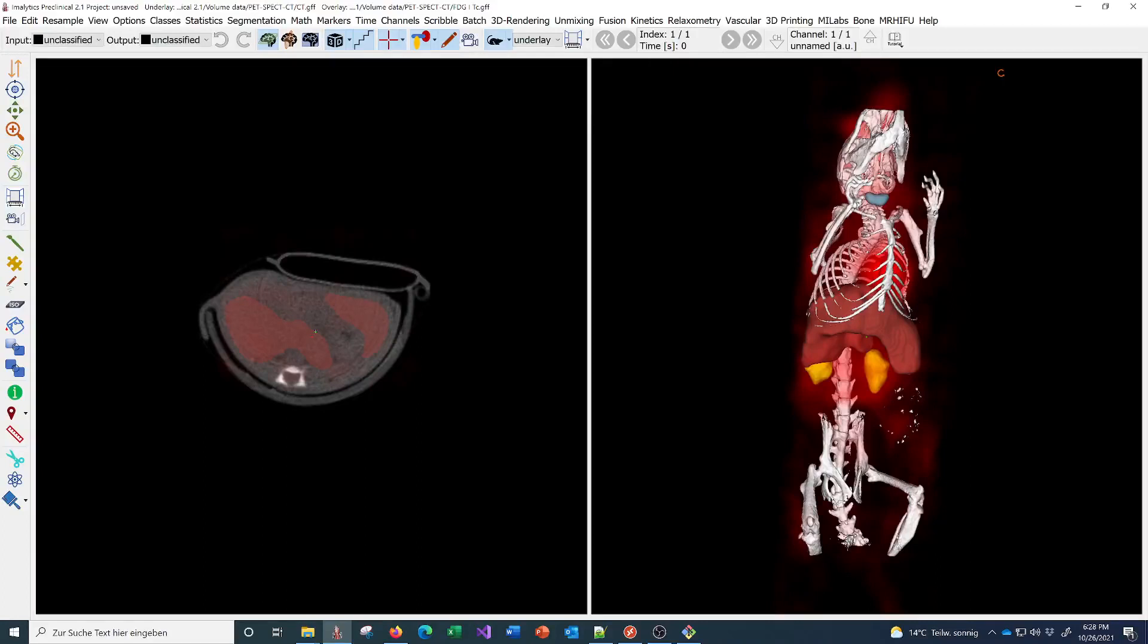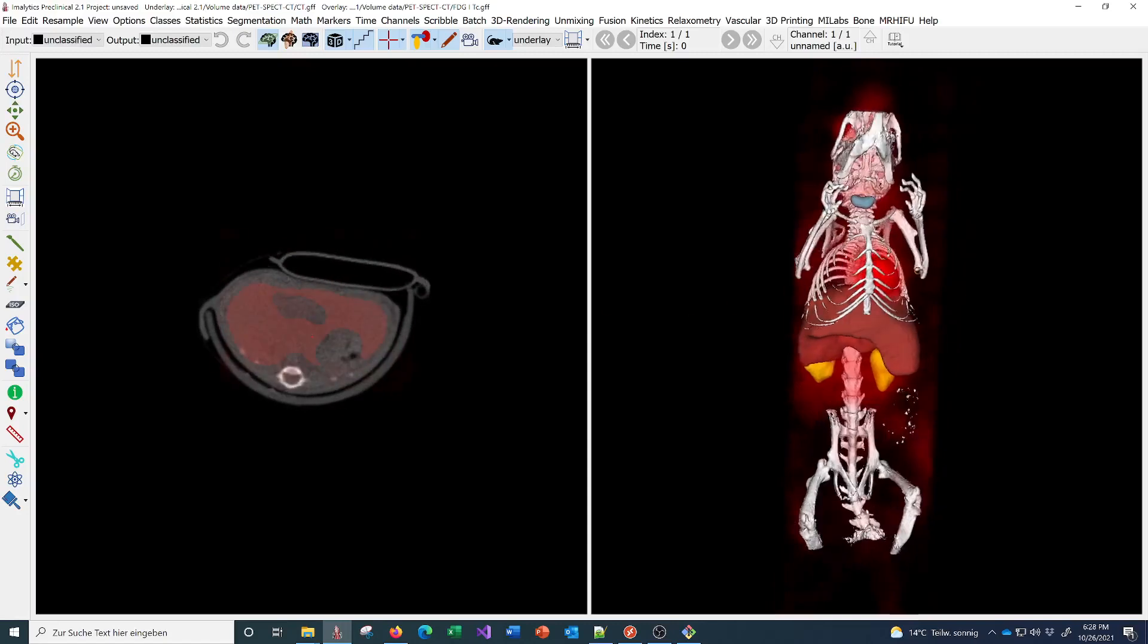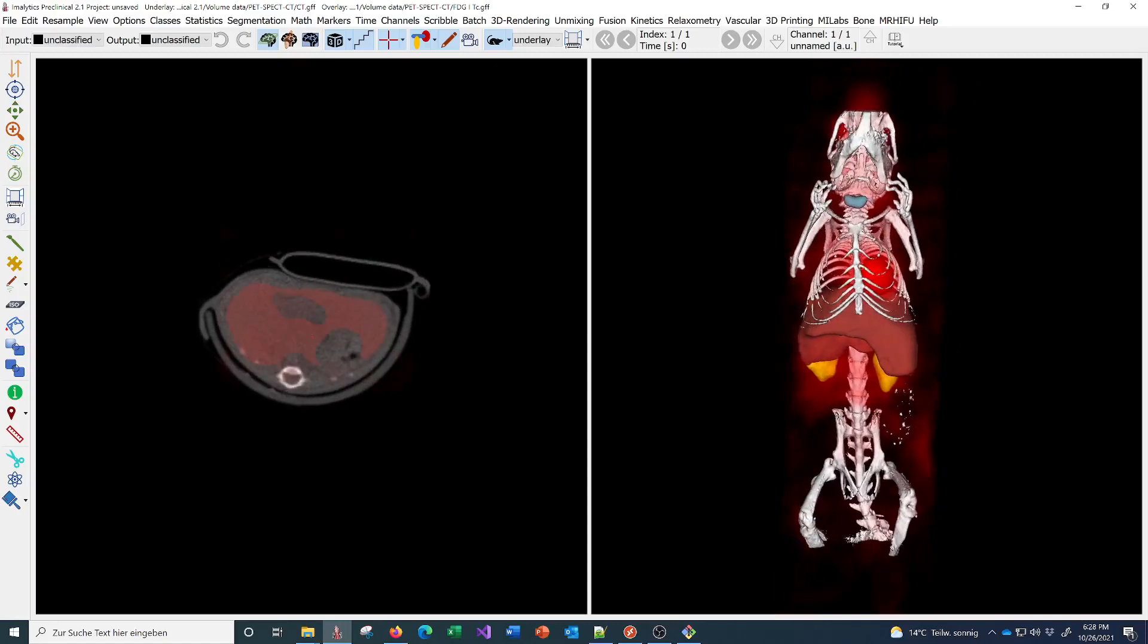This software is meant for multimodal image analysis of preclinical image data. You can see an example of a micro CT scan of a mouse, and we have an FDG scan here in red and a segmentation.